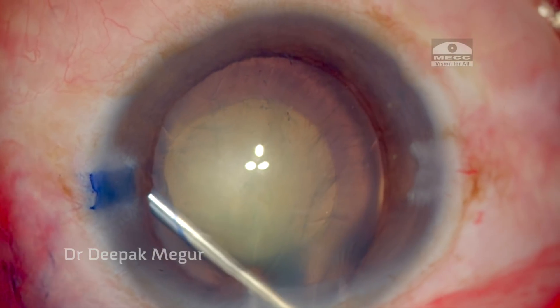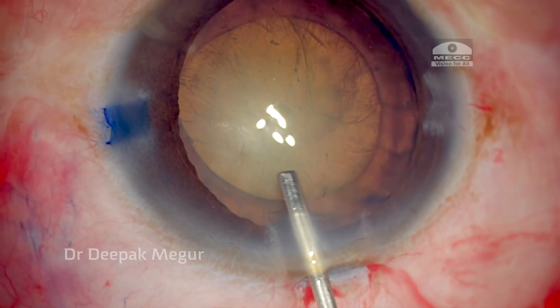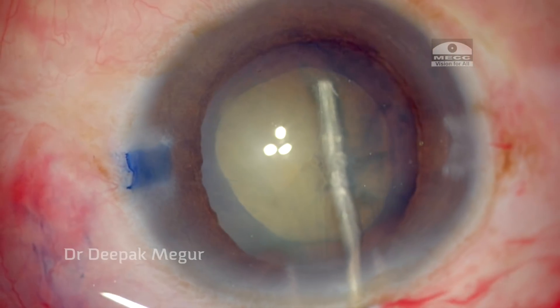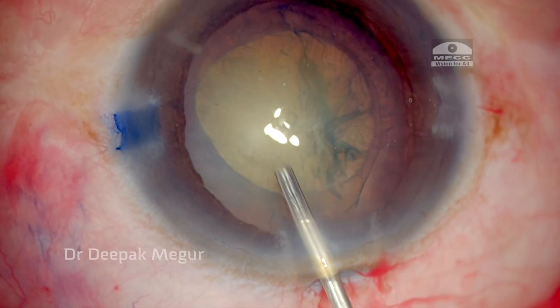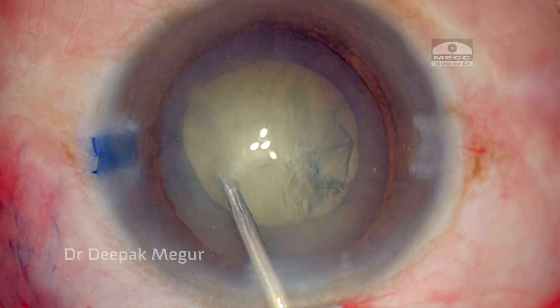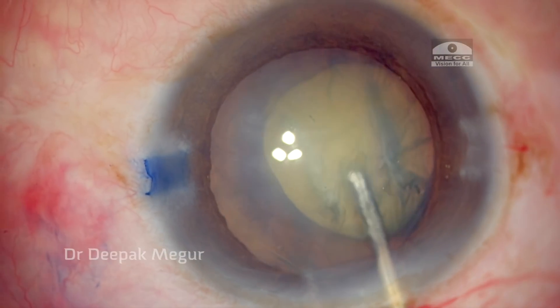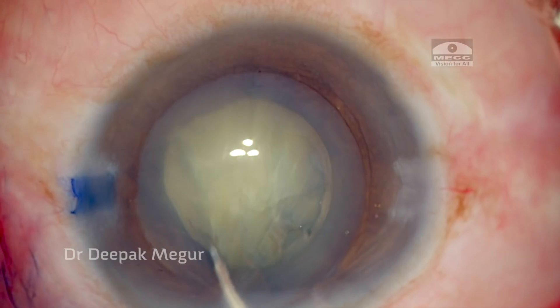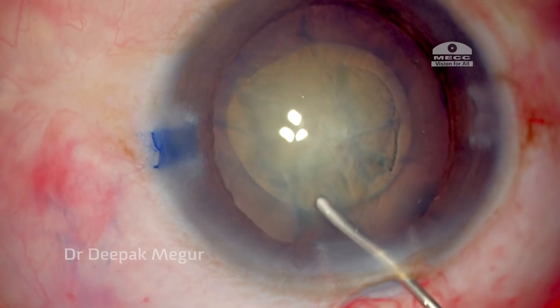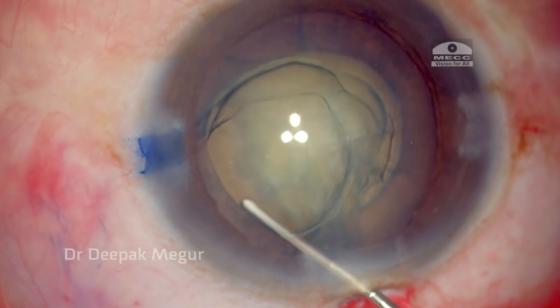Getting a good hydrodissection is always challenging in these eyes because we don't have the counterpressure provided by the zonules. The fluid doesn't spread all around and we always struggle with nucleus rotation — which is very critical, as any nuclear rotation will weaken the zonules still further.